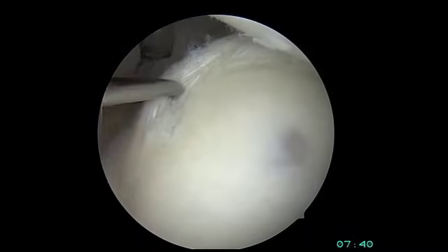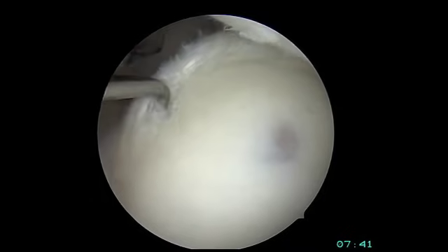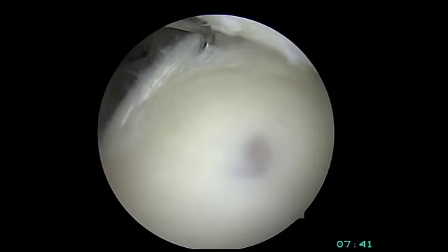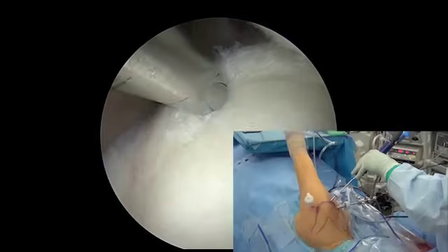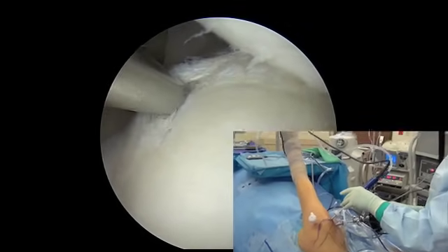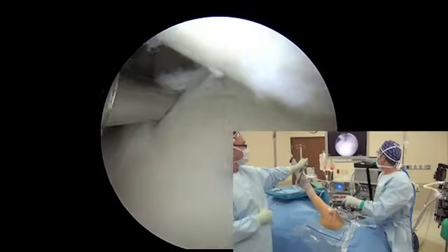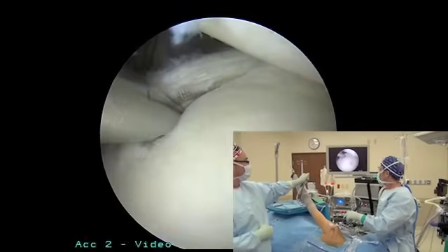The probe is now evaluating the posterior labrum and showing how it is detached from the glenoid, or socket. The next step is to debride the glenoid neck with the shaver, getting it down to healthy healing bone so that the labrum can be reattached and heal nicely.